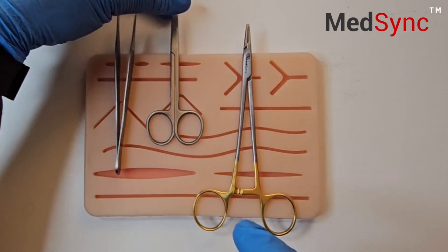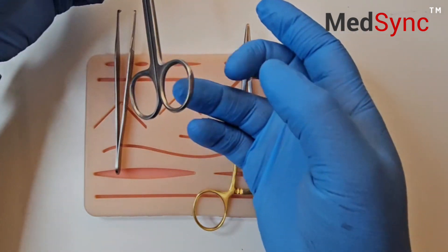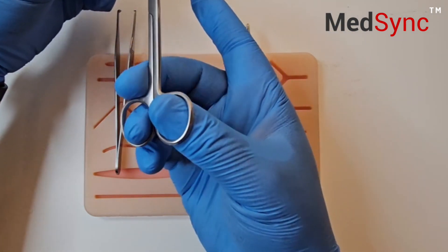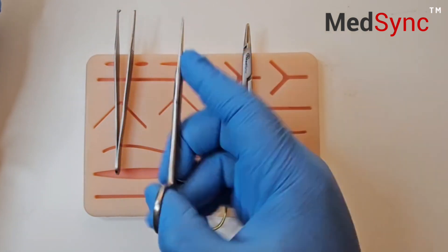The scissors. You hold this just like you do the needle holder. Ring finger, thumb, middle finger on the angle, index finger along the body.